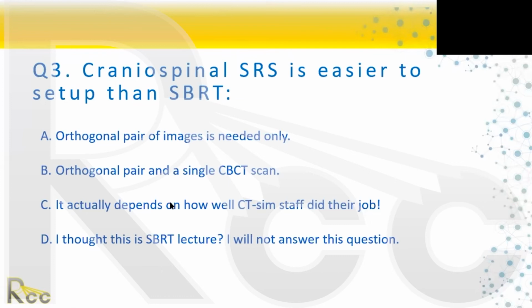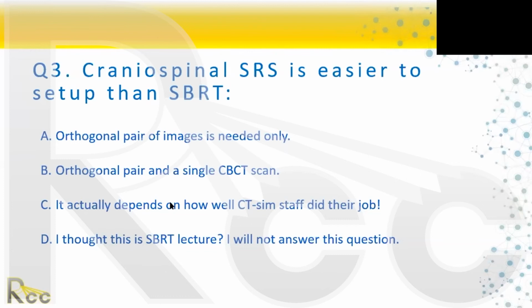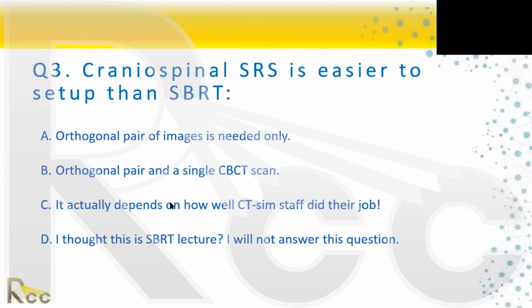Do you apply 2 degrees as the maximum limit for rotational error? 2 degrees, we apply it as a limit before our therapists have to go inside and realign the patient. So we apply all corrections, whether 0.1 degree or 2 degrees. But 2 degrees is the cut off until the therapist goes inside to reposition the patient. Do you accept more than 2 degrees for the translational errors?